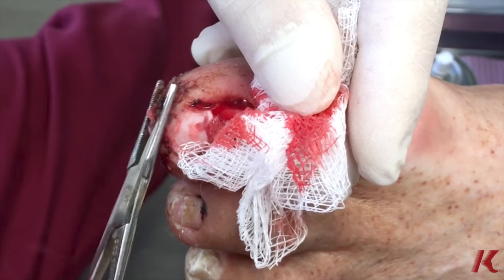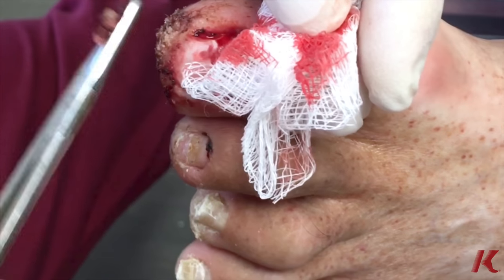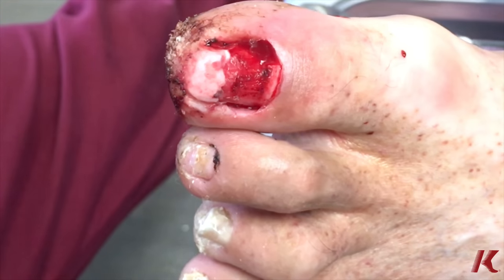So we're just removing more hematoma, cleaning up some of the dried blood. And then we're going to bandage him up.